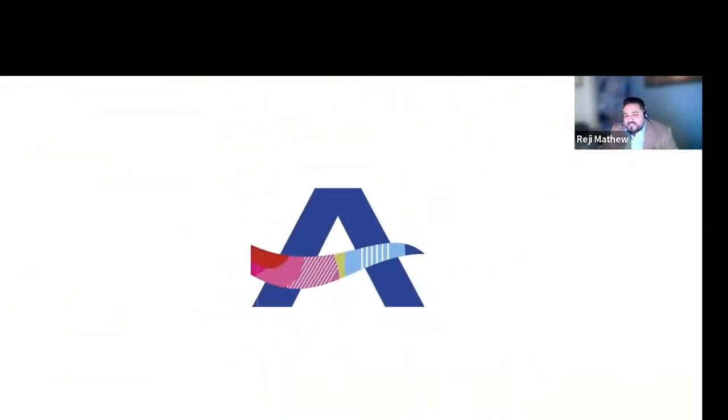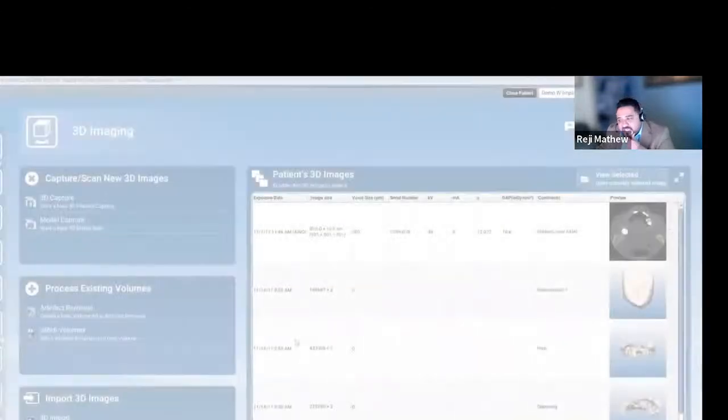Okay, let me go through the implant surgical guide planning. We plan surgical guides in-house, and we have all the equipment to do it. Sometimes it's a lot more work to implement. Our Arizona campus prints, and students are taught to plan a surgical guide, print out their own guide, and take it for the surgery, which they use to place those implants.